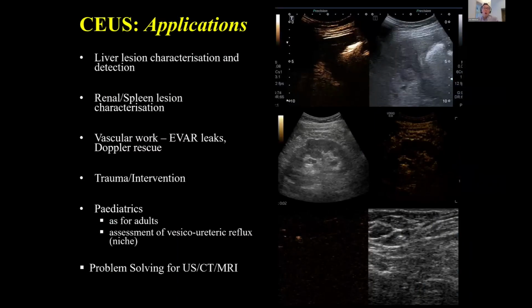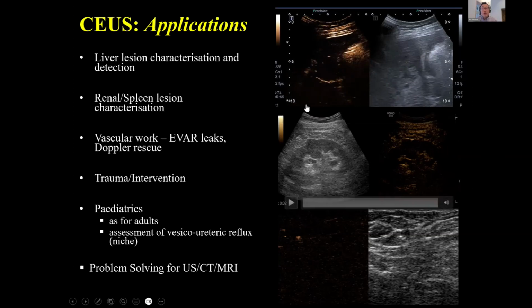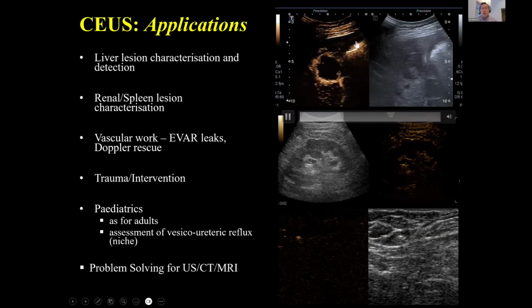Just to let you know what you can use contrast for, and we'll hear more about it in detail this evening. Typically, it's used for liver lesion characterization and detection in radiological departments, but now also more renal and spleen liver lesion characterization.